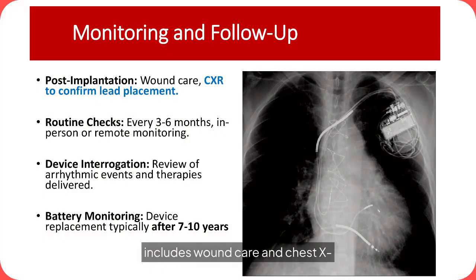Post-implantation monitoring includes wound care and chest X-rays to confirm lead placement. Routine checks occur every 3 to 6 months, with device interrogation to review arrhythmic events. Battery replacement is typically needed after 7 to 10 years.